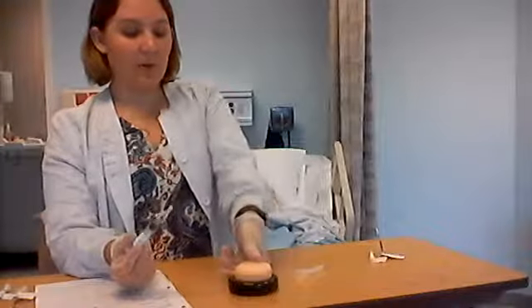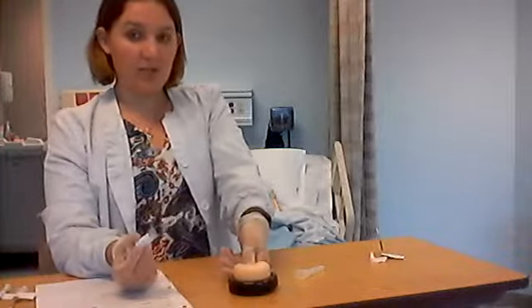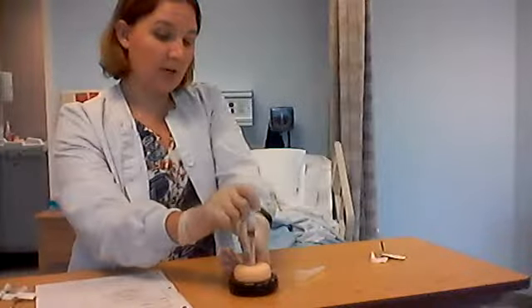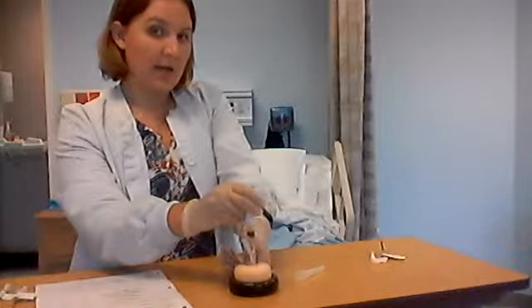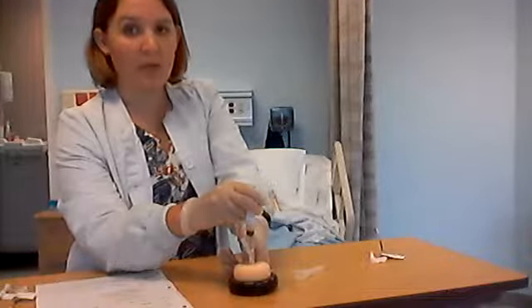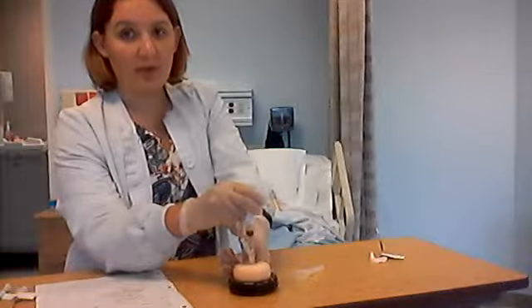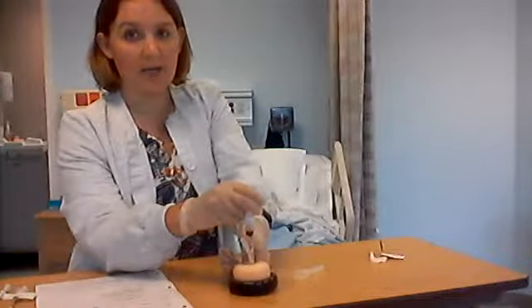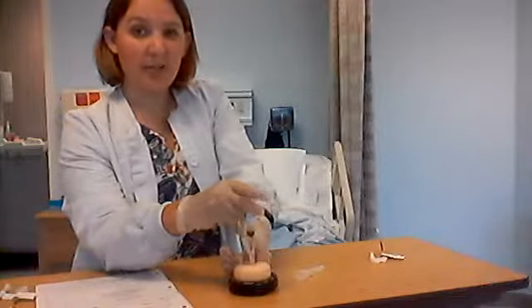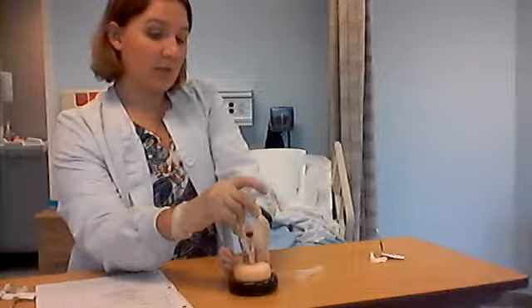With Z-track, we pull the skin and the tissue down or laterally, go in at a 90-degree, kind of like a dart, and then we aspirate. We aspirate because we're checking to make sure we're in a muscle, not inside a vein or a vessel. If we are, that's considered intravenous medication. We don't want to give this intravenous. Okay, so I aspirate. I don't see any blood. So I'm going to slowly inject.